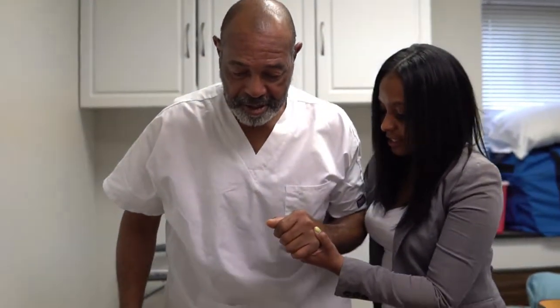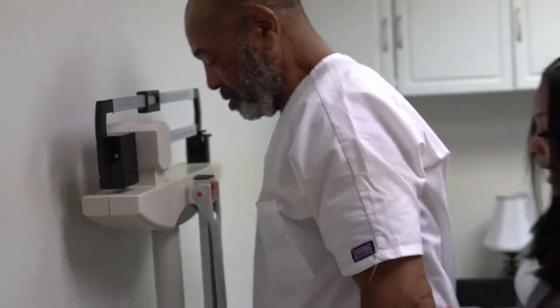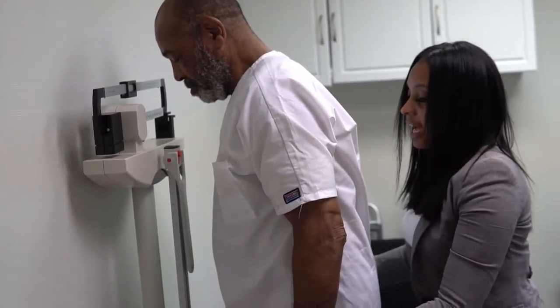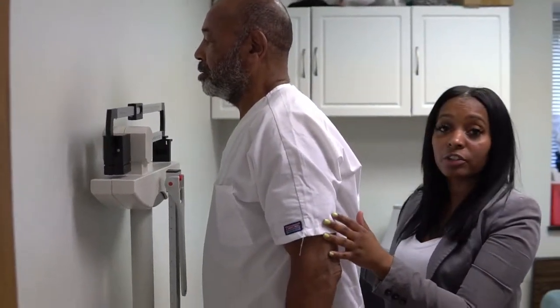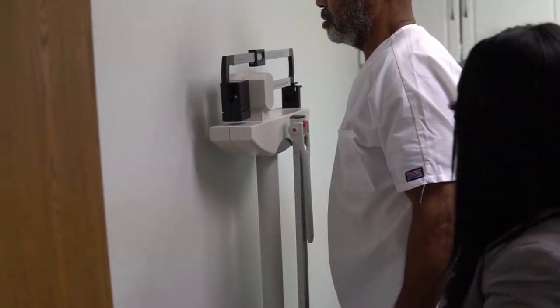Alright, I want you to walk over to the scale. The scale is zeroed out. Please take a step up on the scale. You always want to make sure your resident is able to stand up on the scale and balance themselves. Hands to your side. Do not hold on to anything on the scale because that may alter the weight. He is free from holding on to anything.